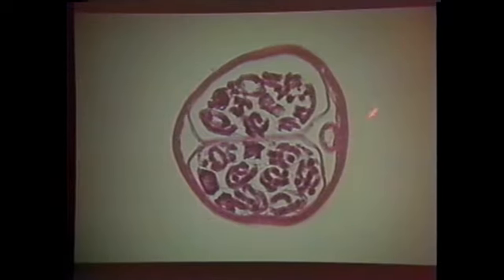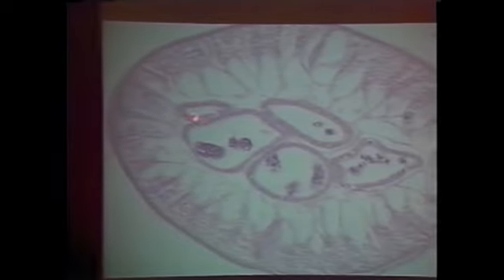Here we go. What's the worm? Can you tell about, well, first of all, the cuticle is so inapparent, it's very thin. What can you tell about that muscle? Not very much. But what you can tell is, look at that intestine, very small. And it's a female, and they have microfilaria in it. Look at this one, coelomyarian muscles, but who cares? It has a small intestine.